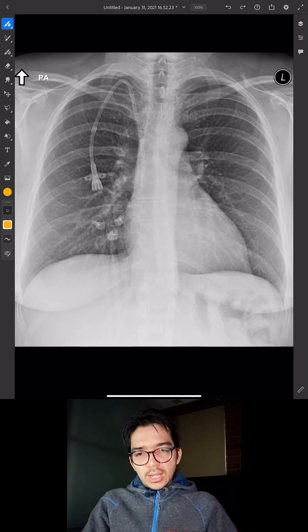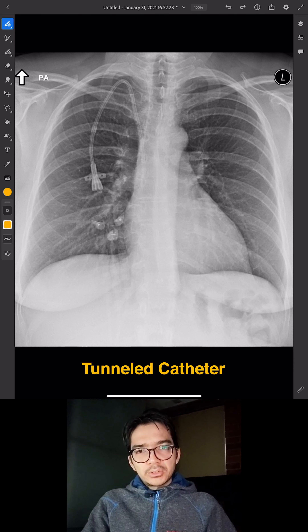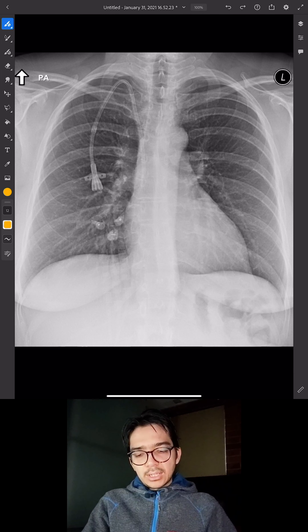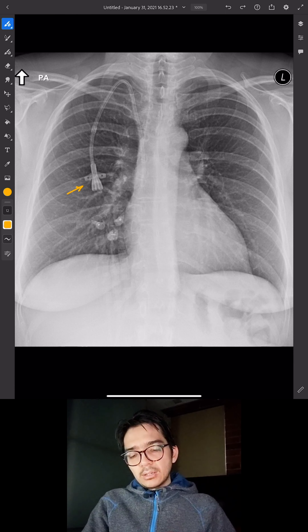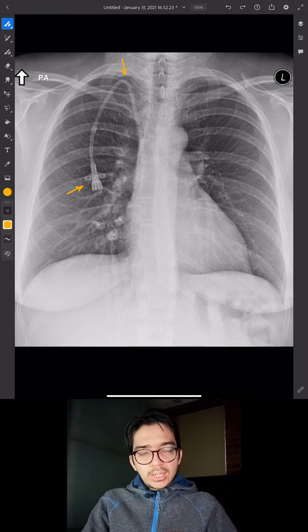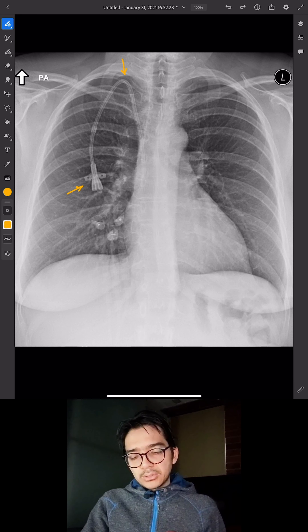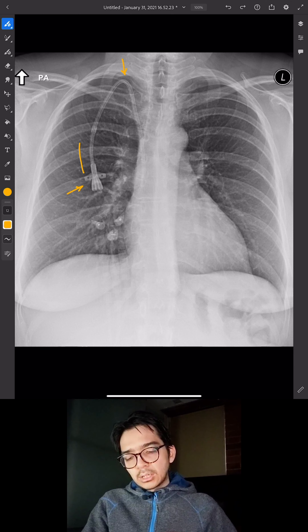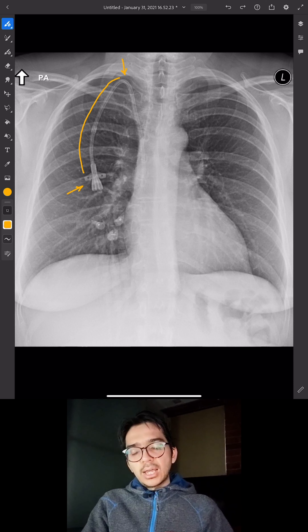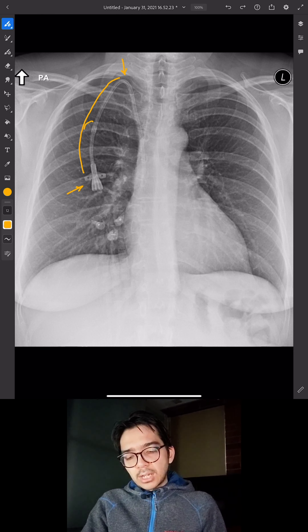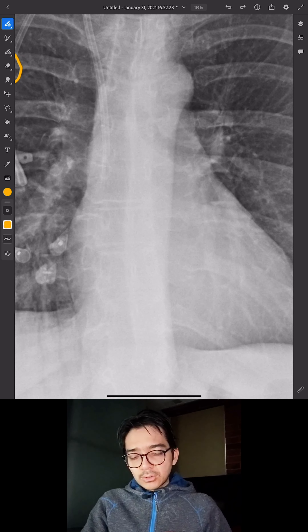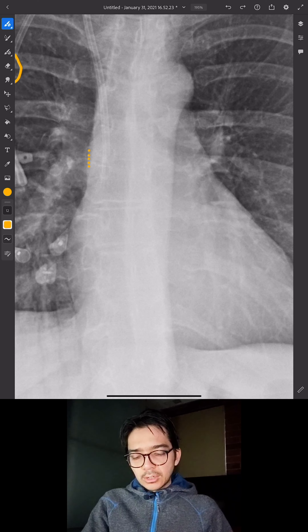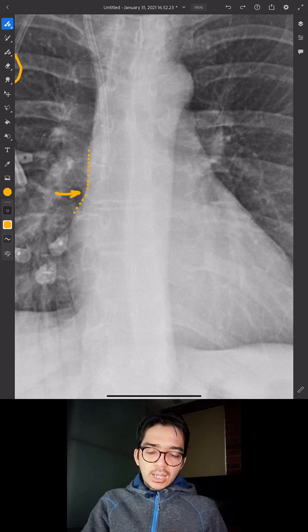Another common type of central line is the tunneled catheter, similar to directly inserted central catheters, but the hub is at some distance from the accessed vein. In this case, it's a right IJ central line — the hub is down here and the portion from there to the vein is tunneled underneath the skin, with a cuff to help hold it in place. Evaluating the position, we can identify the SVC and where it starts to flare out — the superior cavoatrial junction — confirming this is in good position.